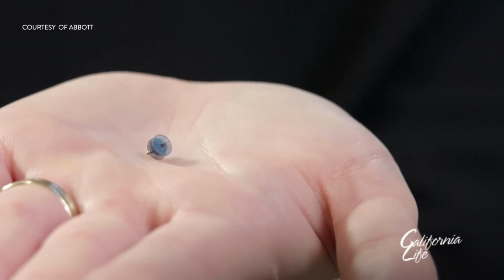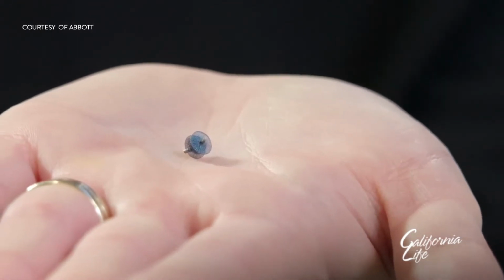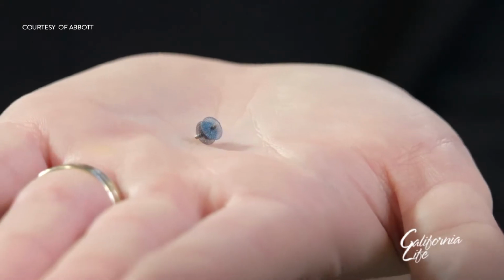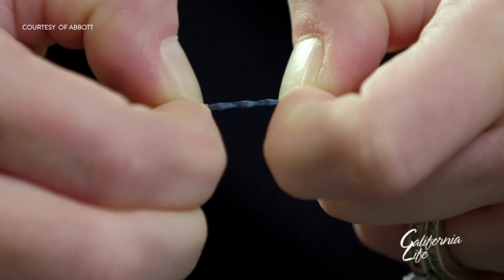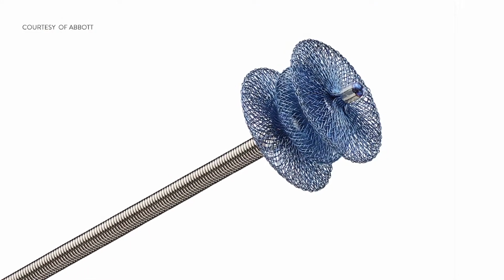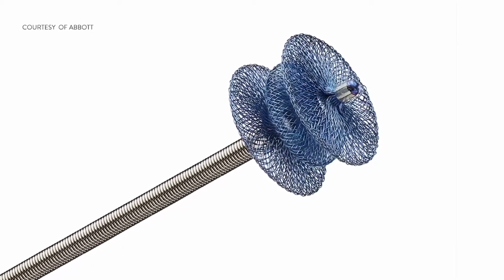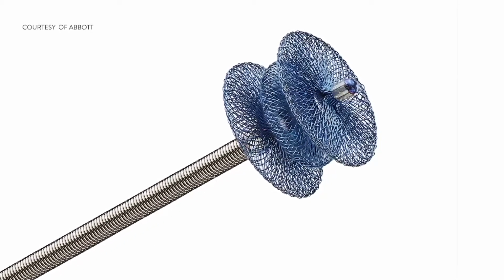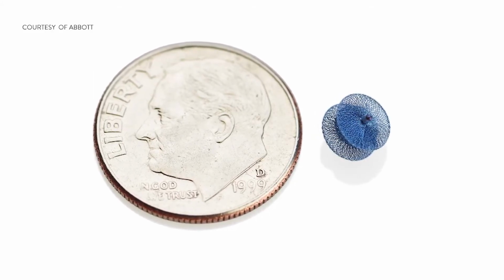So it's a very simple procedure. We go through a tiny pinhole in the groin, like we do many cardiac catheterizations, and we put a catheter, which is like a very soft piece of very thin spaghetti. We wind that up through the heart, watching it on TV, which is something we do every day. And then the Piccolo device is a self-expanding, very soft mesh made of memory wire, and we deliver it directly into the PDA like a plug. And one of the beauties of this device is if it's not absolutely perfect, we have the ability to withdraw the device and choose a different size or a different way to implant it. And once we're completely happy with it and it's fixed the problem, we just release it from its delivery cable and it stays in there for life.